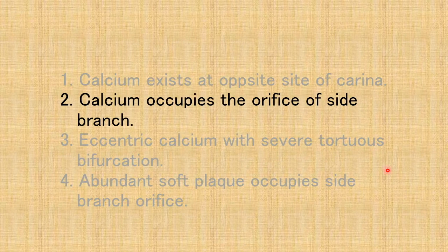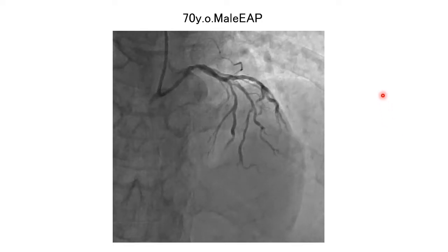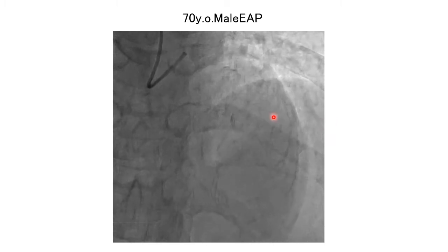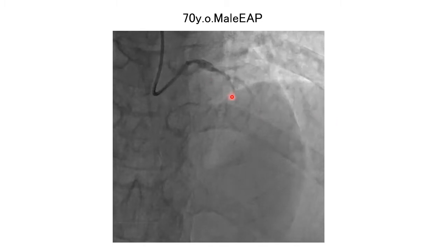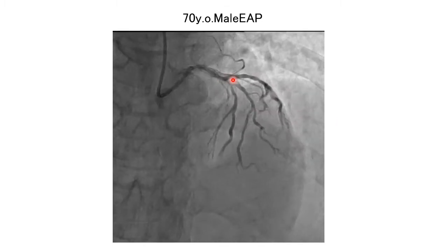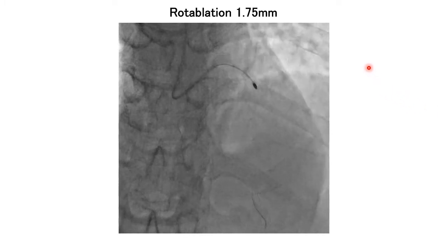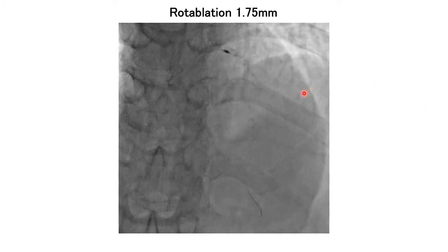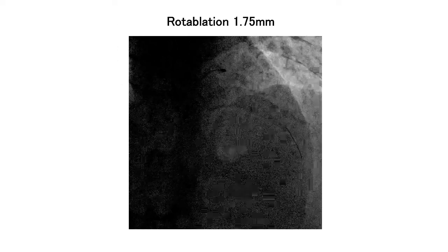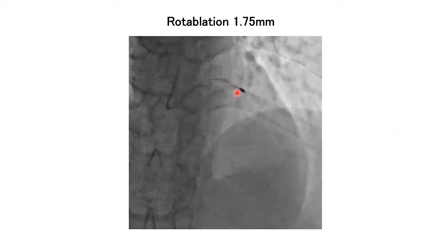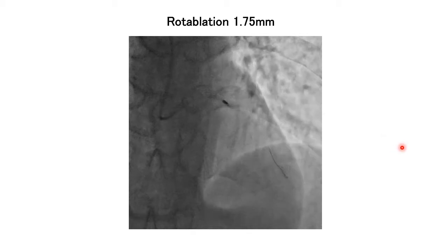The second case is calcium occupying the orifice of the side branch. The case is a 70-year-old male with effort angina. You can see the calcium on both sides of the LAD and diagonal orifice. Rotablation was performed with a 1.75 mm burr in the LAD.